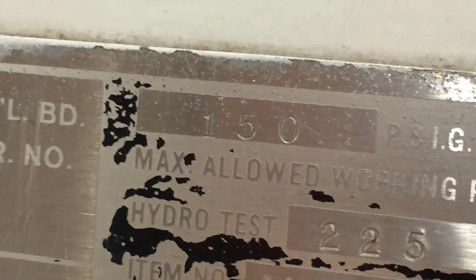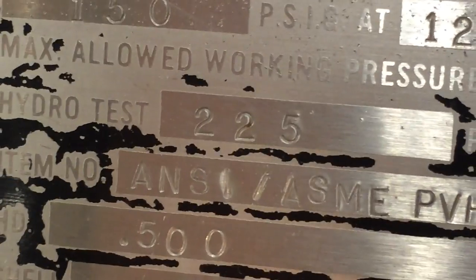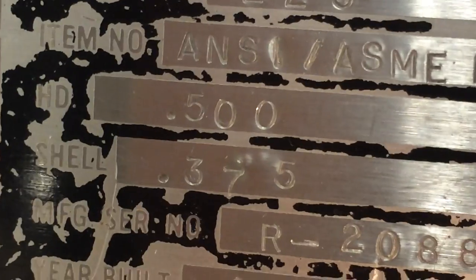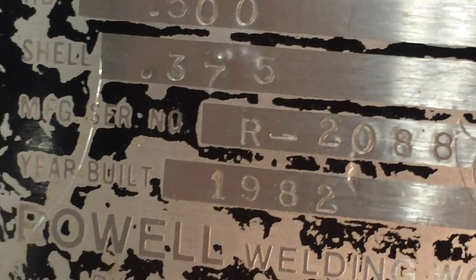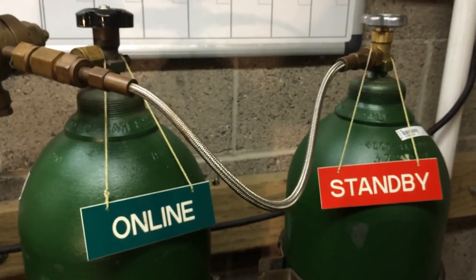This chamber is rated at 150 psi at 125 degrees Fahrenheit. The hydro test is 225 psi. It's an ASME PVHO certified chamber. The shell is 3/8 inch, built in 1982.